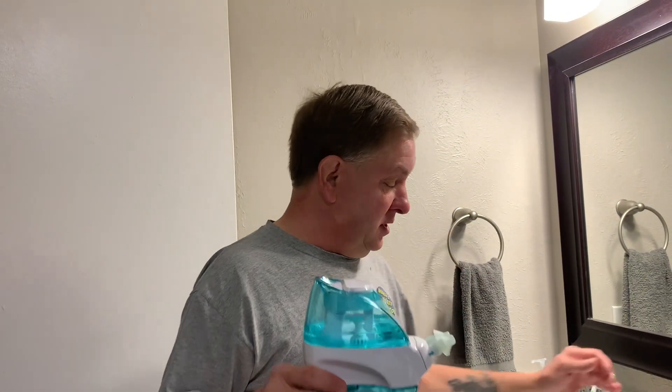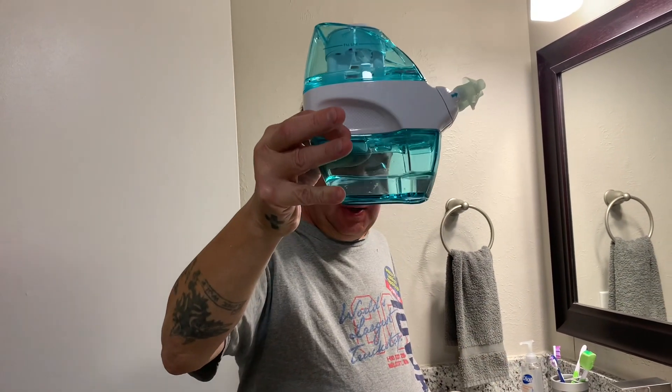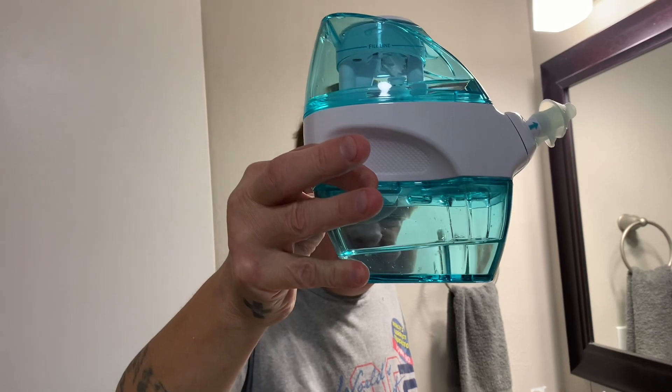It pulls stuff out of your sinuses. What I do is use about half the water. As you can see, there's already gook in the tank. Then I just twist it so it goes back the other way — now it's going to be going in the right side, not the left side.